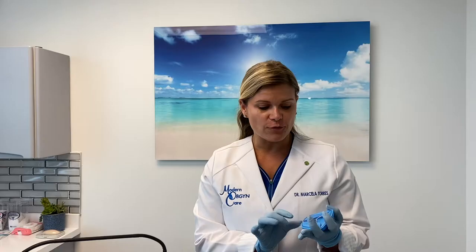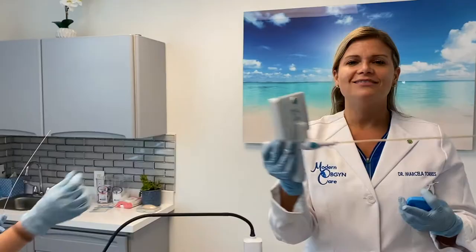For example, an IUD, or the T, which is a device to prevent pregnancy, gets stuck inside the uterus and your doctor cannot easily pull it out. So what do you do? Either you go to the hospital to surgery and you have to go under anesthesia, or you can use what we call the Endosee.